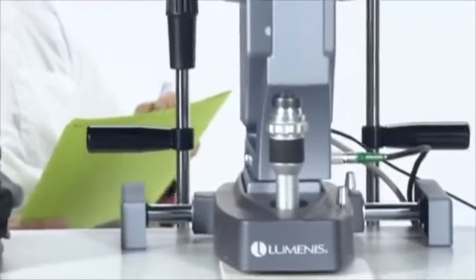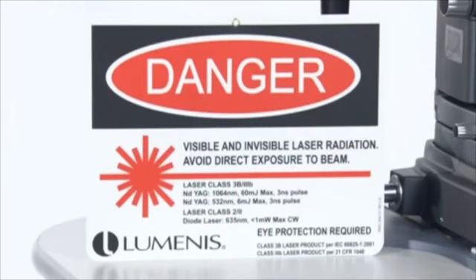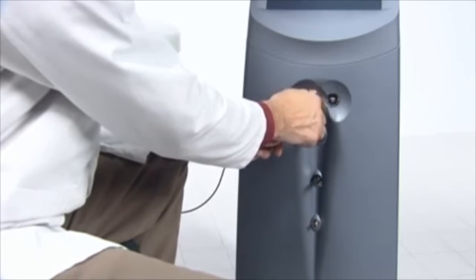First, verify that the laser and its components are properly connected, as instructed in the connection instructions in this presentation. Post the laser in use warning sign outside the treatment room door. Next, verify that the delivery devices are properly connected, as indicated in the appropriate delivery device operator manuals. If necessary, turn on the main electrical service wall circuit breaker.